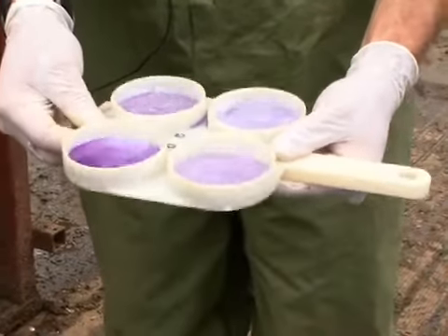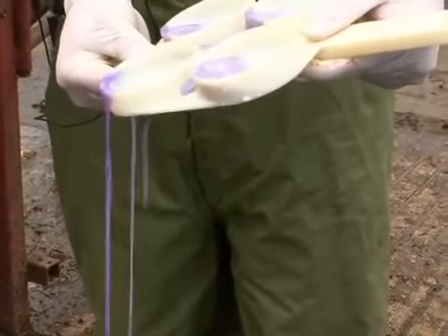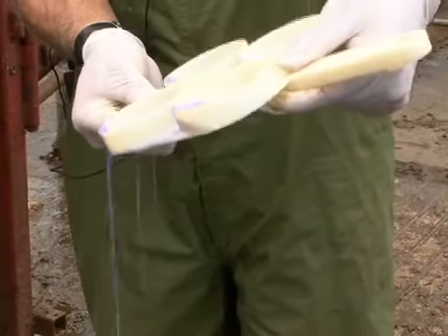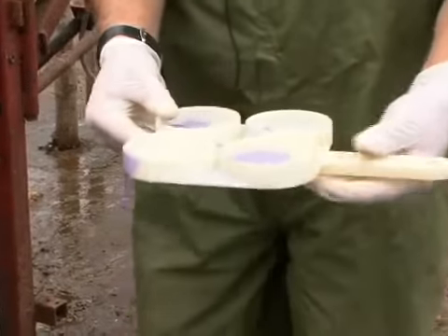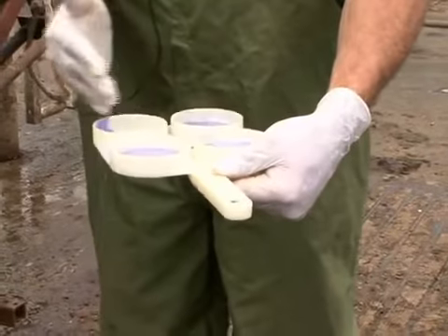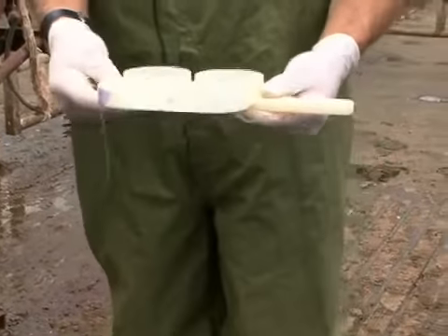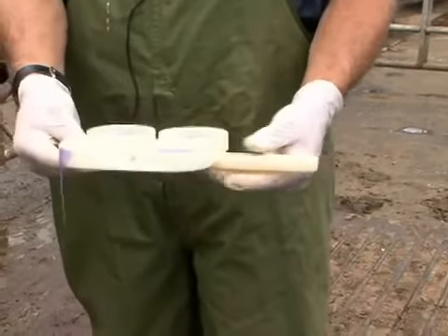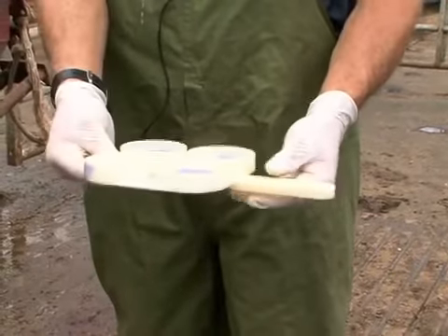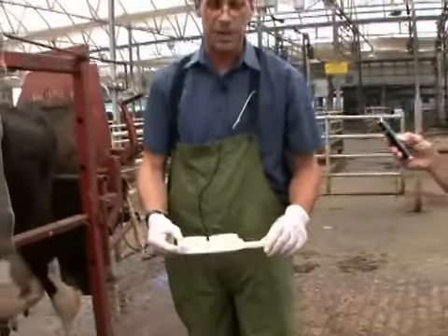So to make it even more dramatic, if I tilt it over and allow it to pour out, you'll see it sticks together and comes out in one big giant clump, which indicates a serious infection in that quarter. So in this particular cow, her right hind quarter has subclinical mastitis, and possibly if we strip longer, we may actually find that she has clinical mastitis. This is a great cow-side test to determine which quarters are high in somatic cell counts and maybe need treatment.